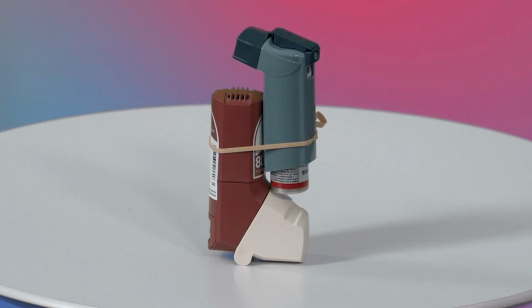It is very helpful to keep your usual rescue inhaler and the PARTICS inhaler together so that you can use the PARTICS inhaler every time you need to use your rescue inhaler. To make it easier, you can use a rubber band to keep both together. If the shape of the inhaler makes it possible, you can nest them like this. And then you can rotate the inhalers like this when you need to take a puff.